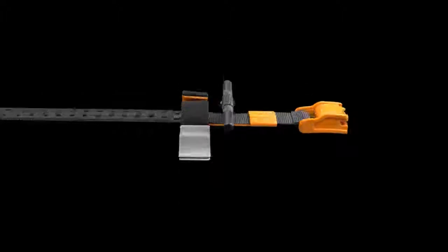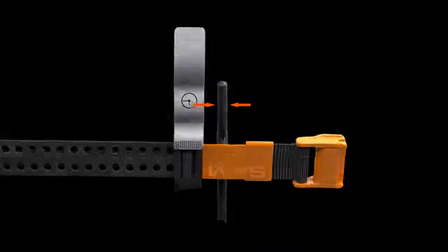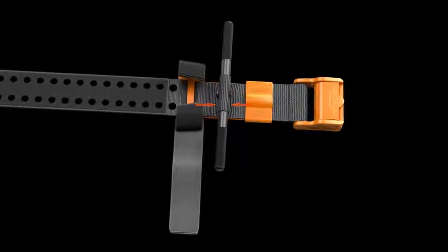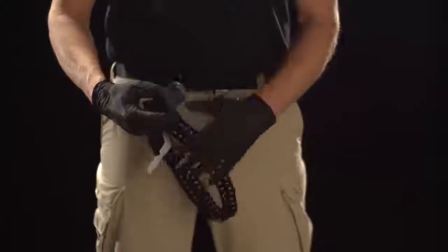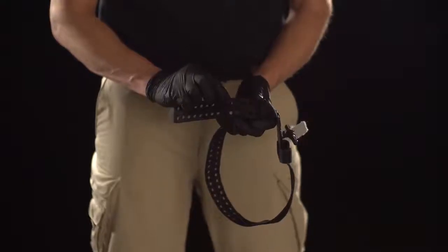Align the first set of strap holes with the outer edge of the C-hooks and verify that the windlass is still centered. Feed the precision strap through the TruForce buckle and place the 13th set of holes over the deactivated prongs.